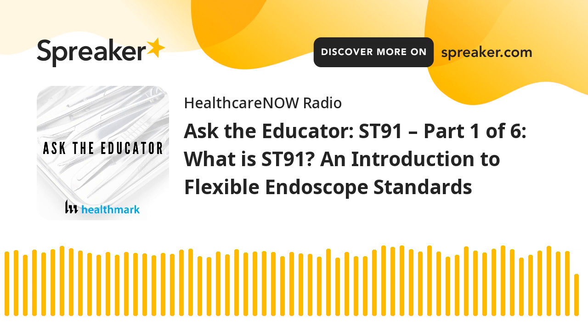If you see the word must in a standard, and this refers to ST91, the word must means it's an unavoidable situation. So those are things that are mandated by government regulation. So think about it as going above and beyond what the standard even says. So if you don't claim compliance with ST91, this is still something that you need to be doing because, as an example, OSHA might be telling you that you have to do that in your hospital.